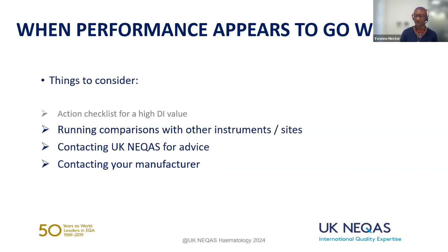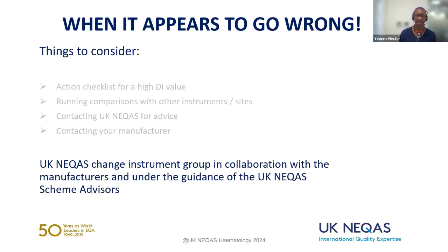We at UK NEQAS always collaborate very closely with manufacturers wherever possible, as this is also a benefit to our services and to you as our participants. And we may contact manufacturers on your behalf with your permission also when we're looking at performance queries. This is not a step-by-step linear approach to the actions, and some of these actions can be taken simultaneously, at the same time.